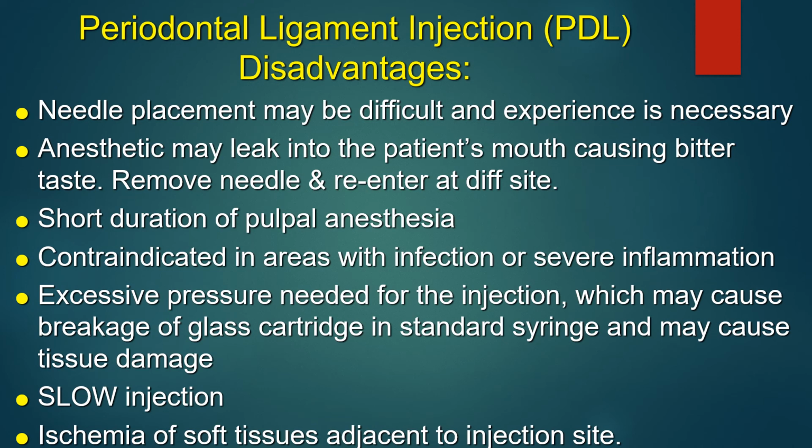So it has to be a procedure that you're going to get in and out of and complete rather quickly. It is contraindicated in areas with infection or severe inflammation. If you give the excessive pressure that is needed for this injection, it might possibly break the cartridge glass. And if you're using a standard syringe, that can always cause tissue damage.